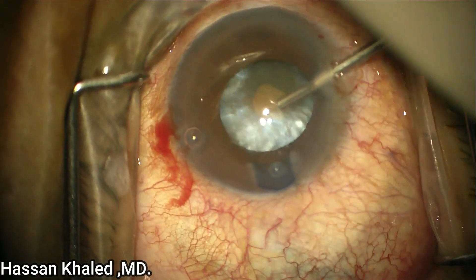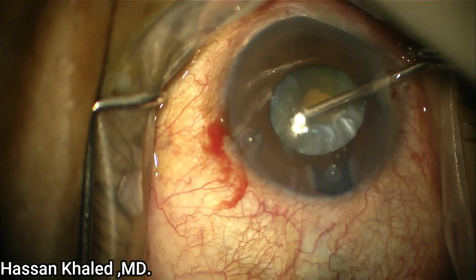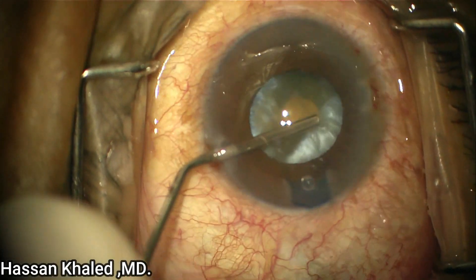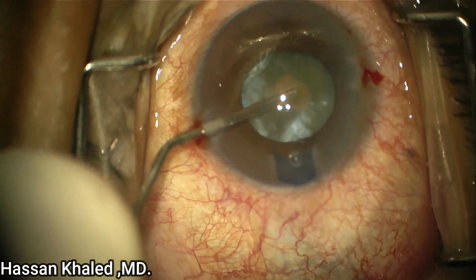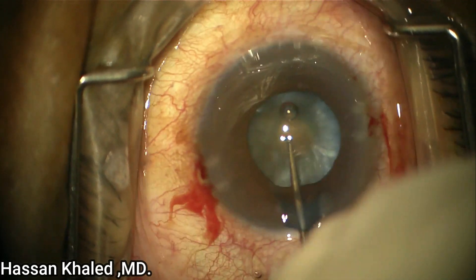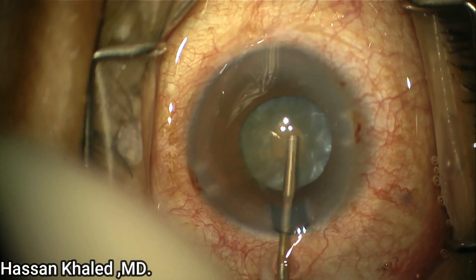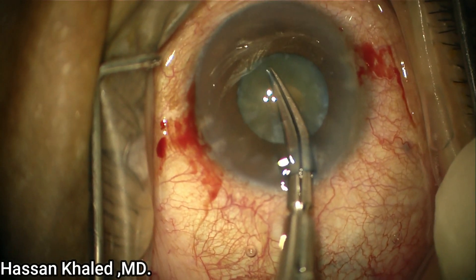Using a 23-gauge needle, I also go through the paracentesis on both sides to complete the aspiration of the liquefied cortex and to decompress the whole intralenticular pressure. You can also see I am rotating the nucleus to press the liquefied cortex behind the nucleus to aspirate it. As you can see, I have now completed the decompression.